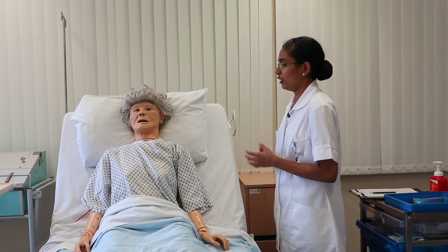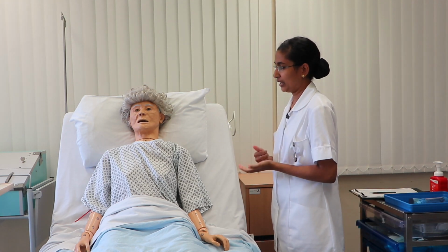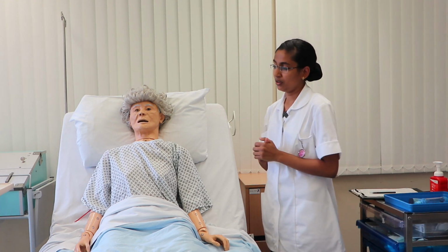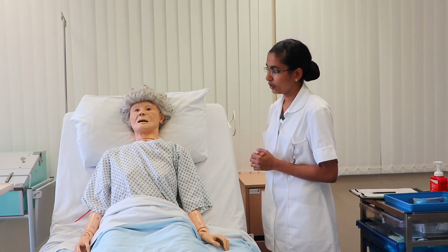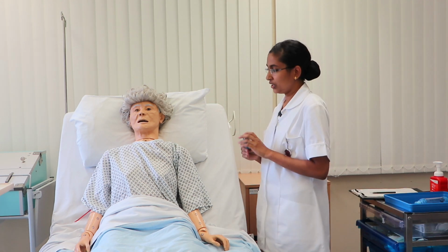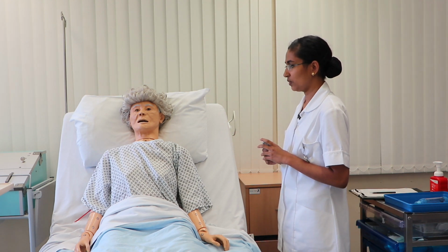Okay, so if you need me, just shout. I will be in the other room and I will do my aftercare. Is that all right for you? Okay, and I will leave the aero chamber with you for the next use. Afterwards I will clean it with soap and water. Is that all right for you? Okay, and I will place the inhaled medication near you, and whenever it is needed, you can use it also. Is that all right?